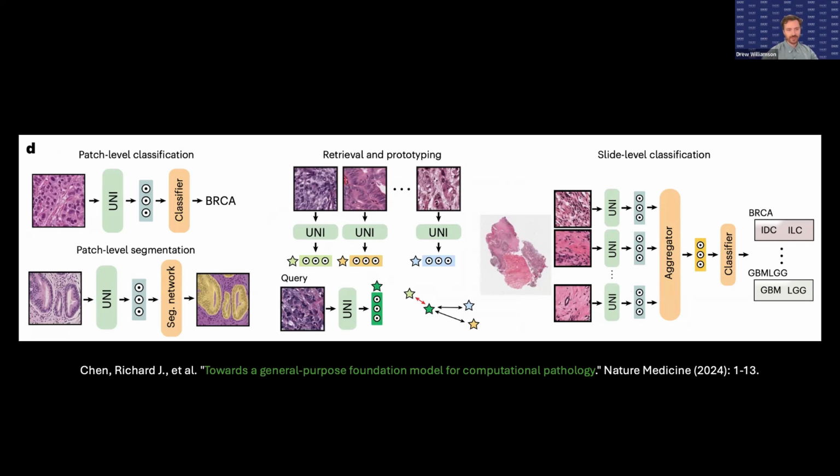And so our group in Boston is one of the many groups that's published a paper about foundation models for computational pathology. And here by foundation model, I mean a model that you train, often using a large amount of varied data, and then you use it for not one downstream task, but a full variety of downstream tasks. It sort of forms the foundation that you can use for many things down the line.